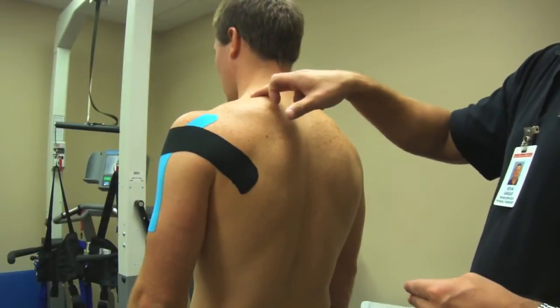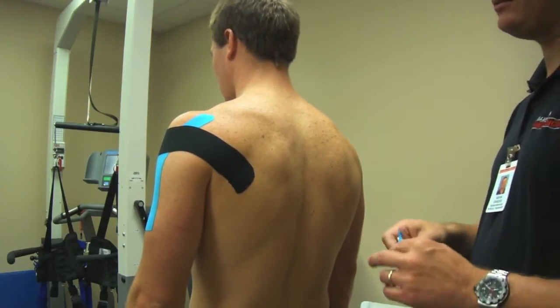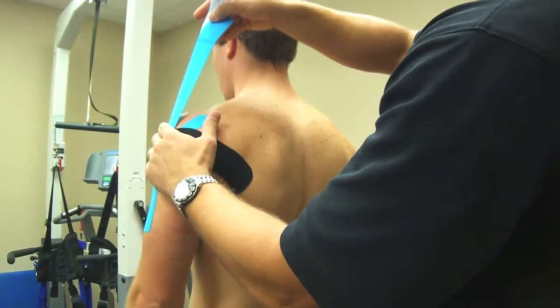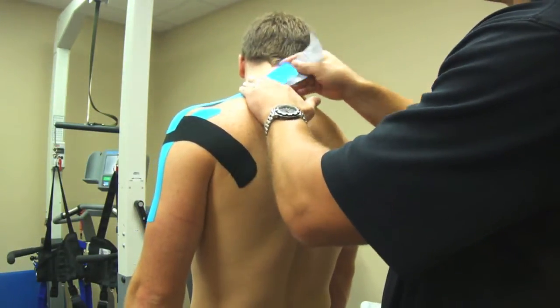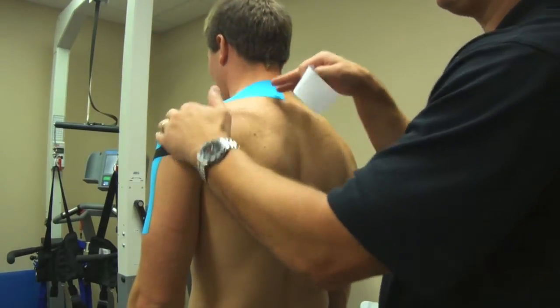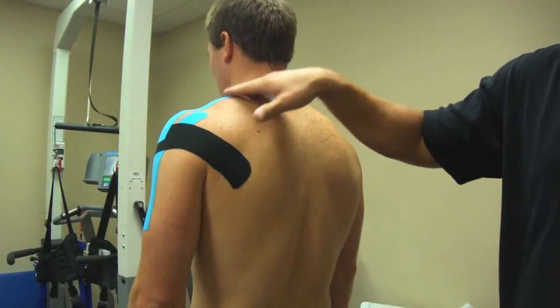A lot of times the upper traps get real stiff and tight with shoulder pain. So another popular one is to come in and inhibit the upper traps. Tilt your head to your right. There you go. And so going right along the muscle belly of the upper trap. That's going to give the upper trap muscle a little feedback to relax and not pull on the neck and shoulder so much. It really helps to decrease the pain, and a lot of patients that say they can't sleep through the night due to shoulder pain, this helps out a lot.